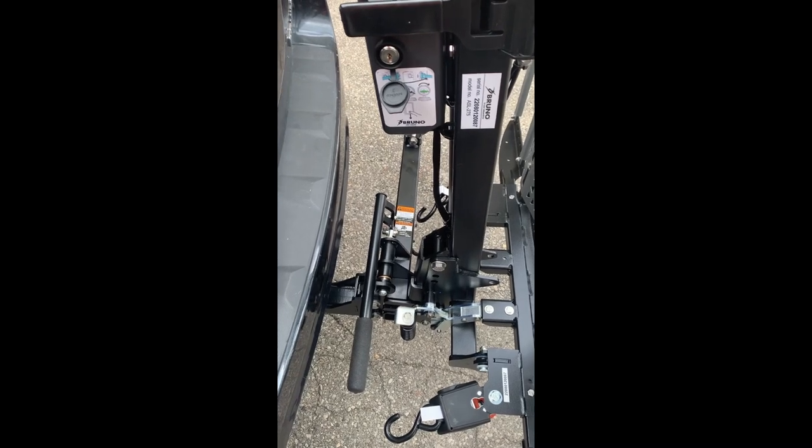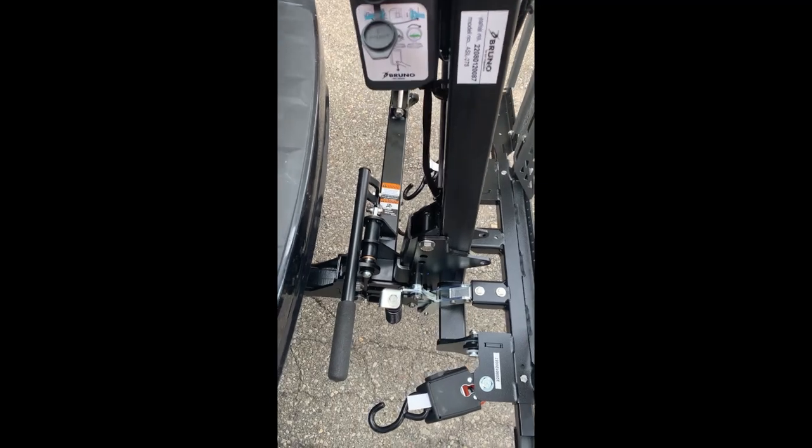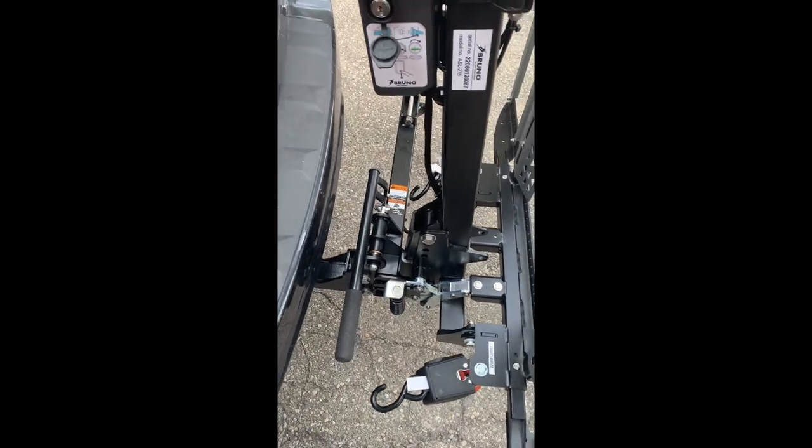This lift has come equipped with a swing away arm option. What that means is this will allow the lift to swing away from the vehicle to have access to the trunk.